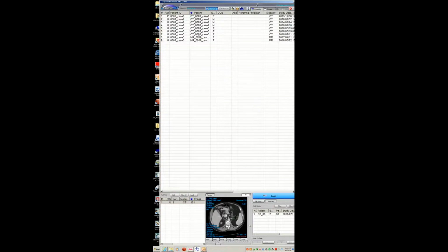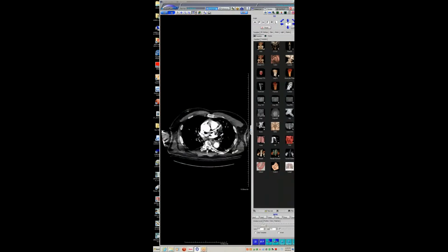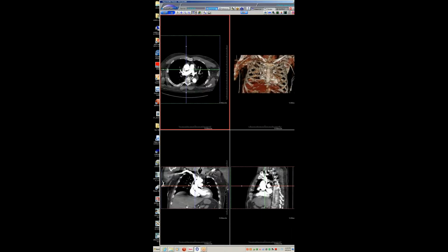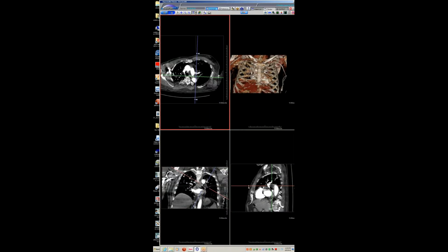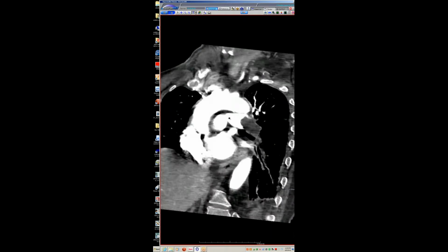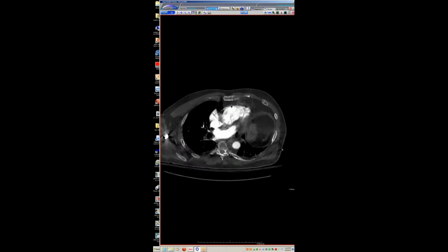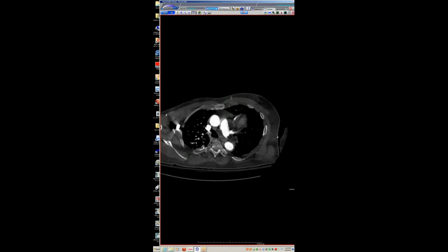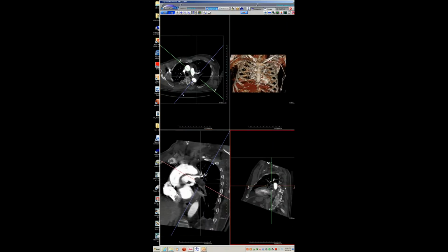I guess they were kind of aggressive about moving it, and it broke apart, and needless to say, not the best study because the person was a little short of breath. I know people have seen fat emboli, but I don't know if people have seen fat emboli this fatty and this large. So this is actual big chunks of fat from the person's lipoma that embolized into the left PA, as well as, I think it was primarily the left PA. And so this is a caval lipoma embolization due to attempted snagging of this thing interventionally.